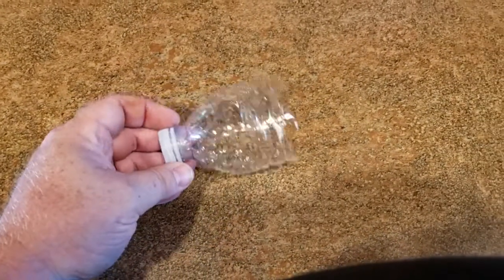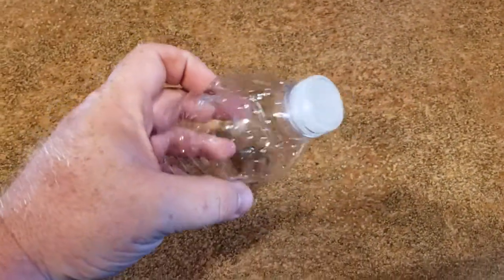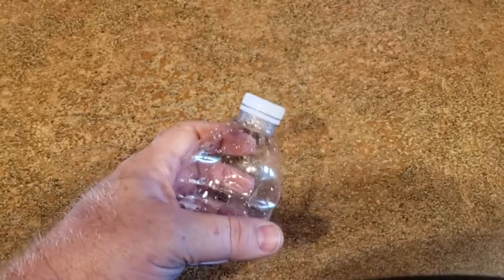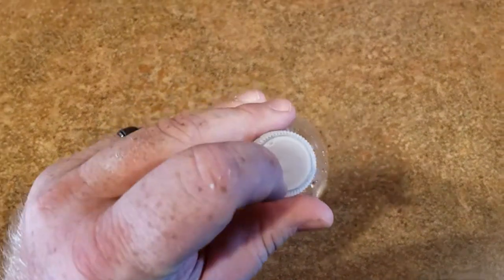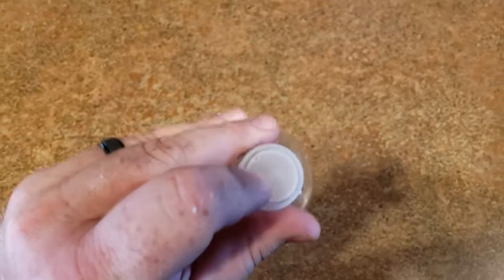So now I've cut that in half, and I have kept the side with the lid here. What you want to do is go ahead and screw that on tightly, and then just go ahead and drill a hole right there in the center of that.